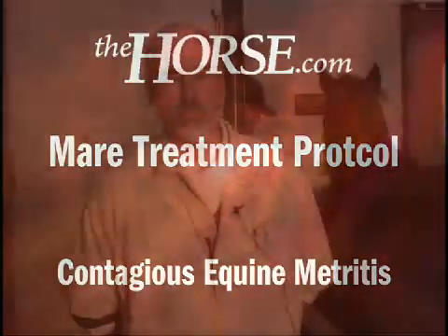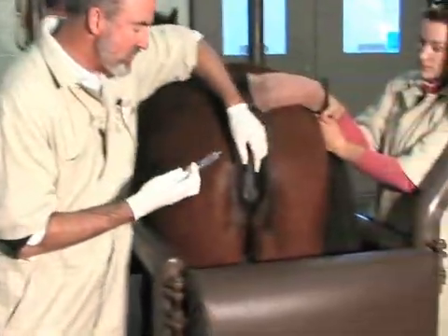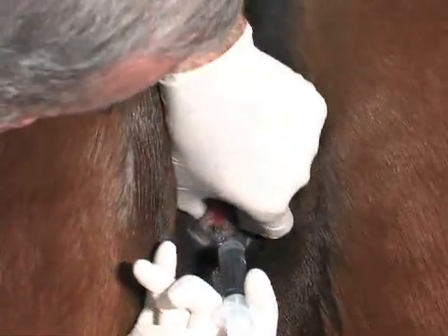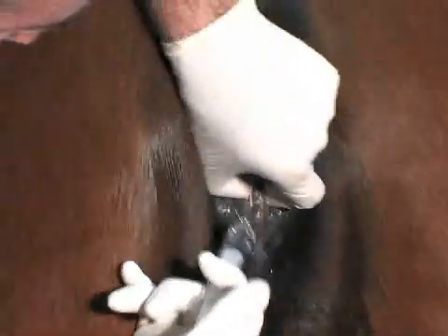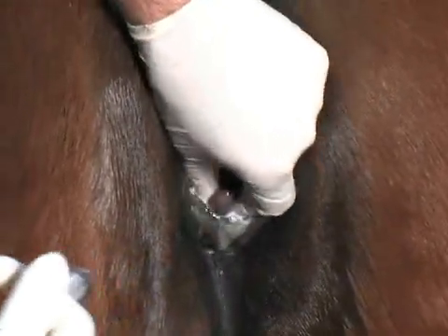We're now going to demonstrate the procedure for treating mares that are either at risk — they've been exposed to a CEM-infected stallion possibly — or mares that have been imported from CEM countries. What you'll first do is clean the clitoral fossa and sinus region with hydrogen peroxide. We're doing this to allow the antimicrobials that we're using the best access to those sinus and fossa regions that might be infected.